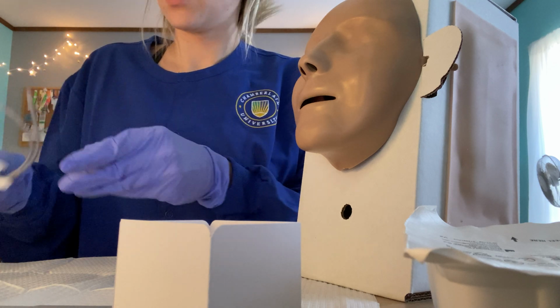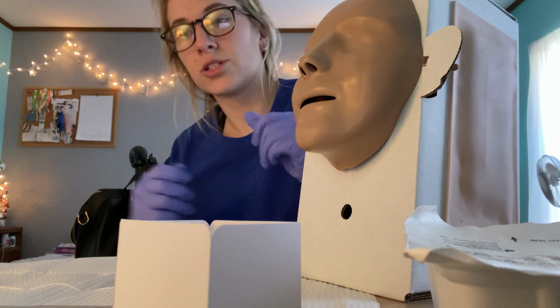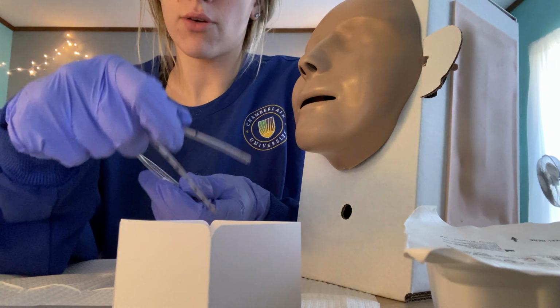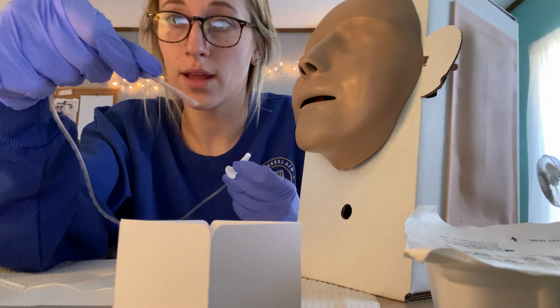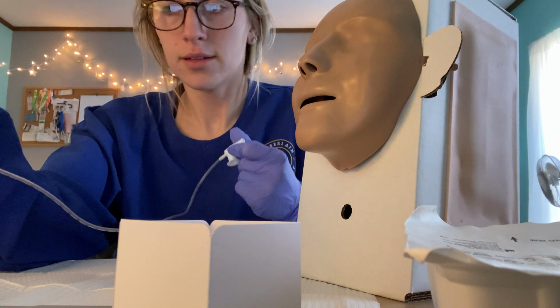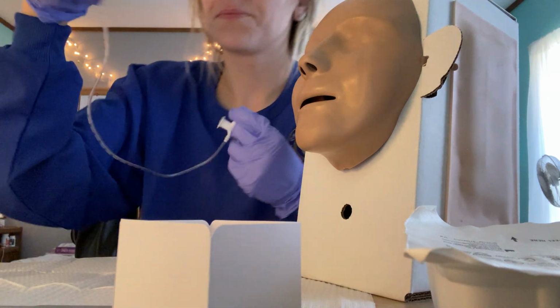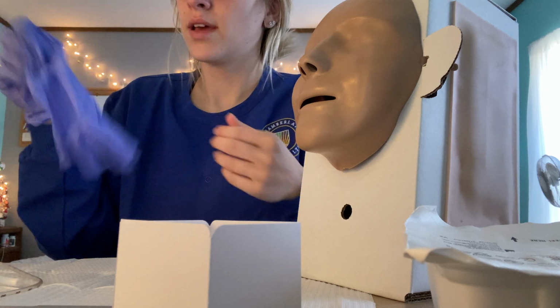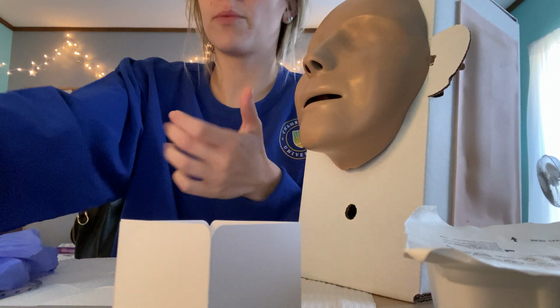catheter supplies in the appropriate bin. And while I am discarding it, I want to make sure that I am assessing my tubing that was on my catheter. I'm going to assess COCA. So COCA is color, odor, consistency, and the amount that was on the tubing. So I want to make sure I'm looking for any abnormal coloring, any purulent discharge or blood or anything of that sort. So I'm going to remove all of that, and then I'm going to take my gloves off and discard my gloves into the proper bin, perform my hand hygiene.